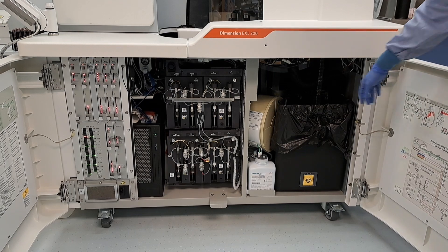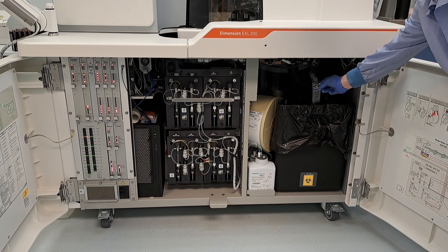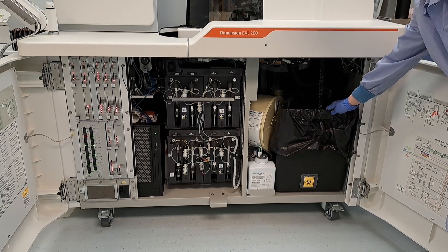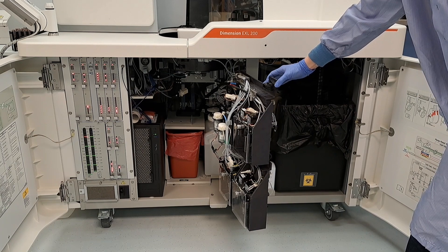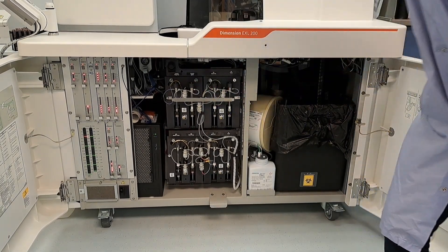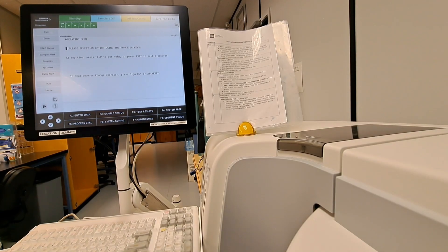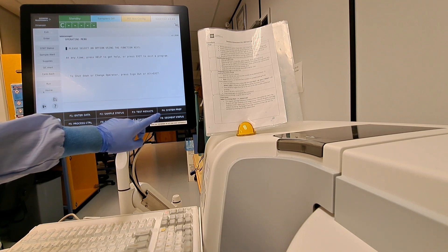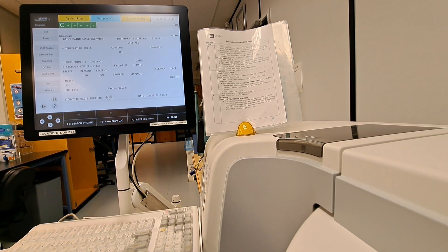To empty the cuvette waste, we would simply cut between 6 and 12 inches hanging down from the analyzer, between two formed cuvettes. At the college, we may discard this into general waste. Emptying the cuvette waste can be logged into the analyzer. From the home screen, we can press F4, system prep. From here, we can go F8, daily maintenance, F7 for maintenance logs. Here we can toggle with the enter button yes or no if we've changed or emptied out the cuvette waste. You could press F1 to store maintenance.